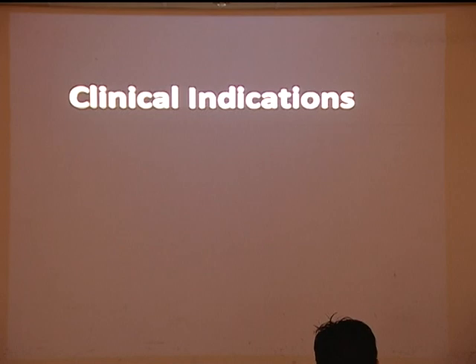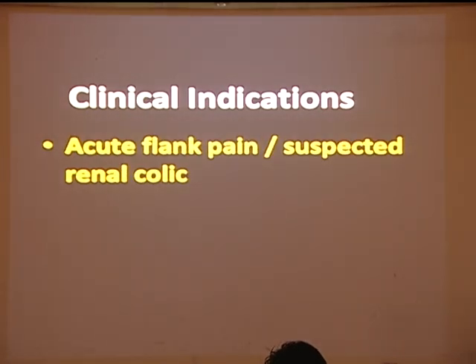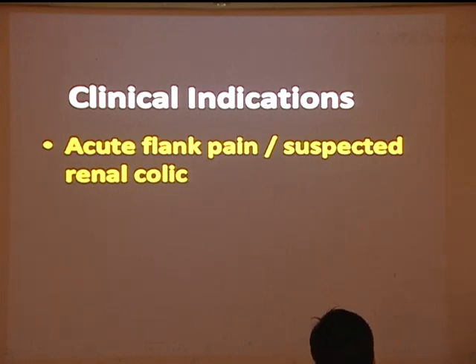This ultrasound is not like the renal ultrasound done by the other doctor. We did this ultrasound for some specific questions. The first indication is maybe acute flank pain with suspected renal colic. So you want to see if there is hydronephrosis or not, if there is obstruction.